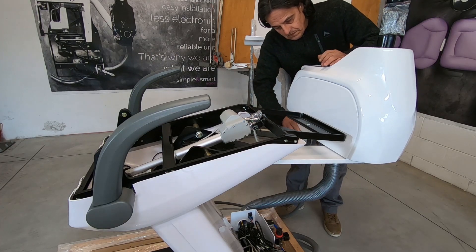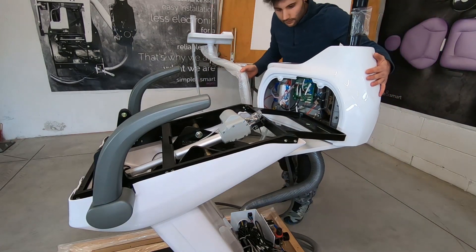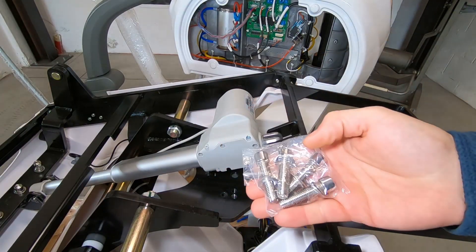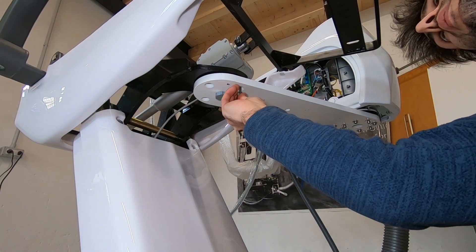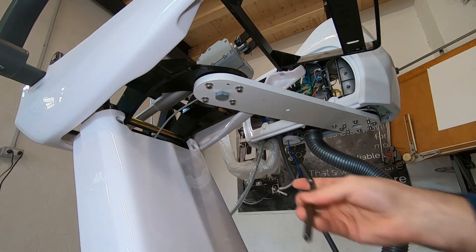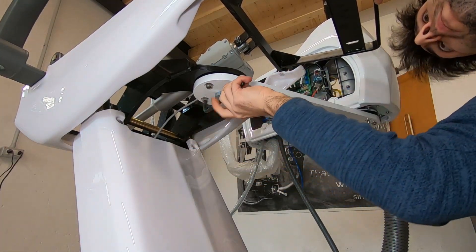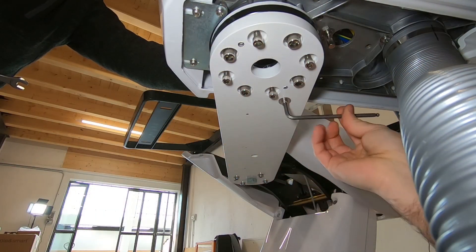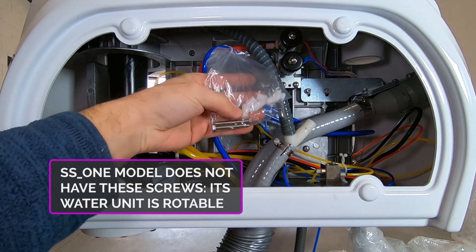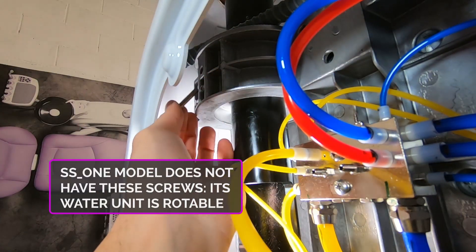Remove the plastic cover and turn the water unit. Fix the water unit arm in the right position. Remove the screws fixing the water unit, then fix the water unit with its two screws.